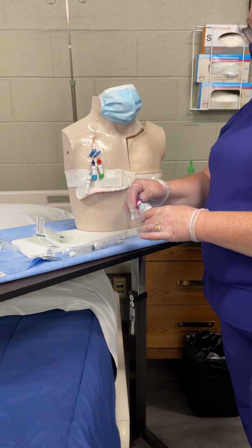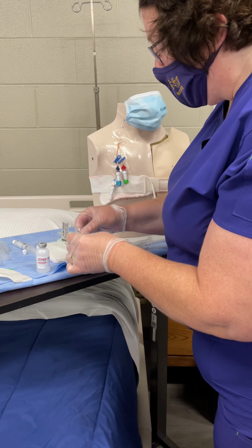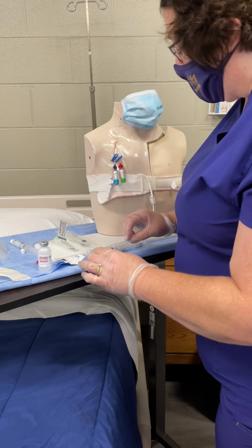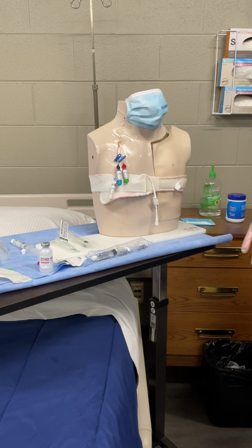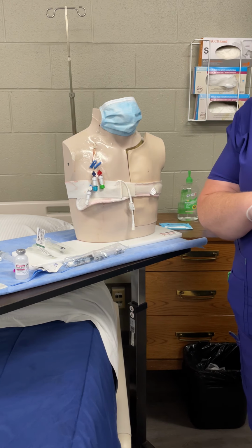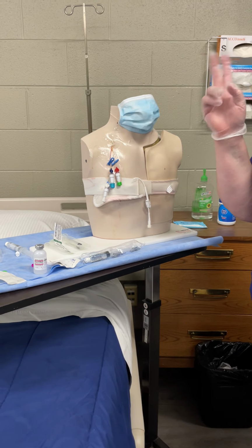Also, when the person's on Lasix, what is Lasix? It's a diuretic. Awesome. And whenever we give Lasix, what is our main vital sign that we're concerned about? Blood pressure. So you never want to give Lasix quick. The normal rule is 1 minute per 1 mL. So we're going to want to give this medicine over 2 minutes because it's 2 mLs, okay?